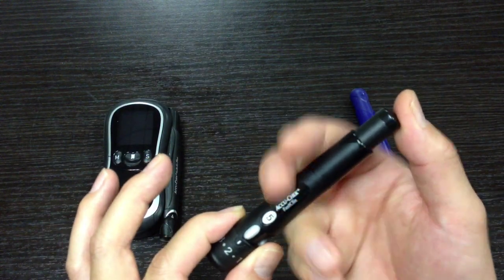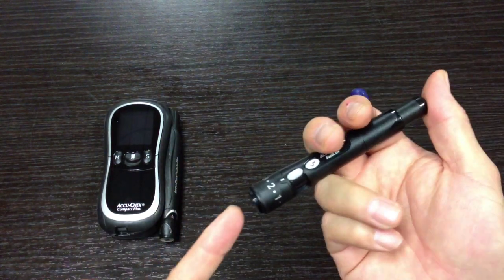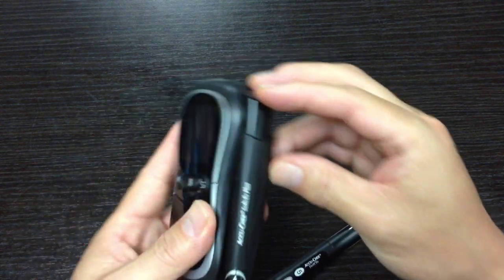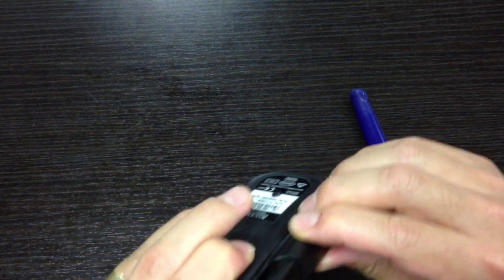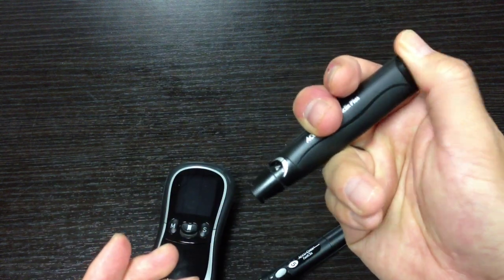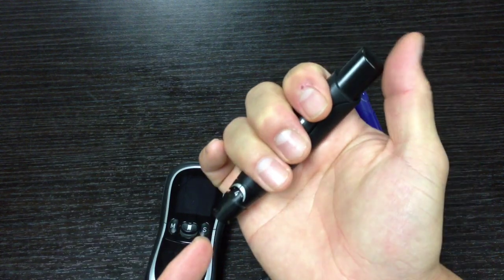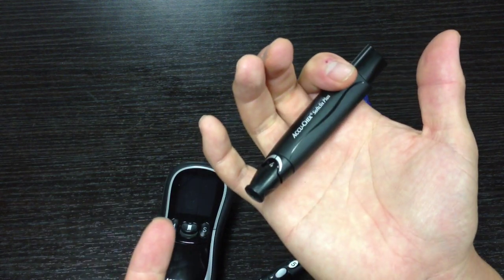They got this idea — instead of having two steps, just one where you press down and prick your finger — from their AccuCheck Soft Click Plus. That's how that one works, except it doesn't use a drum and you have to put individual lancets in there. On that one it's actually two steps where you engage it and press down to get the prick.